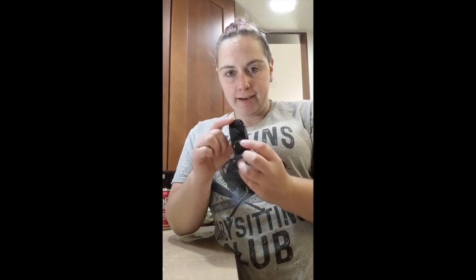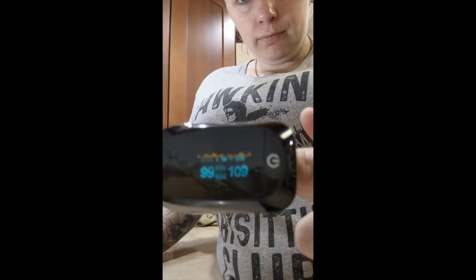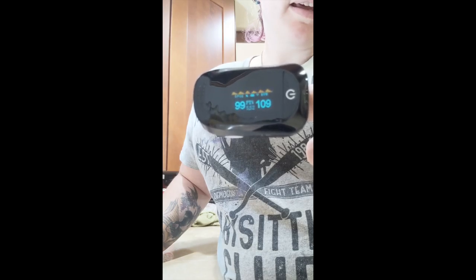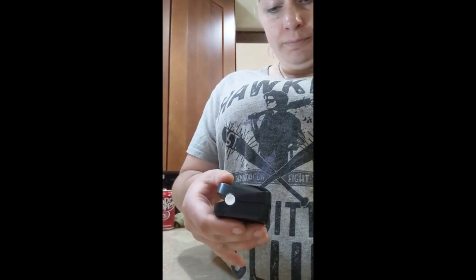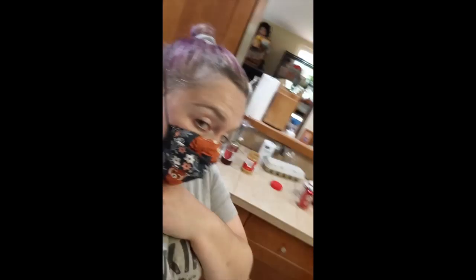Here is my initial read: 99. I forgot to mention, the mask is your standard double-layer cotton elastic, plain jane pleated mask.